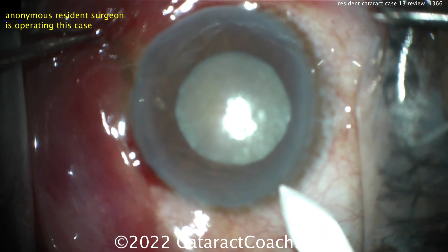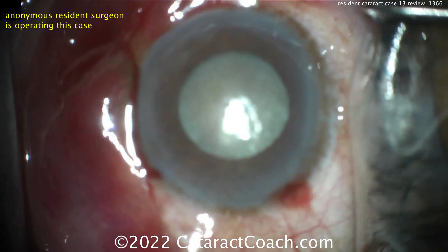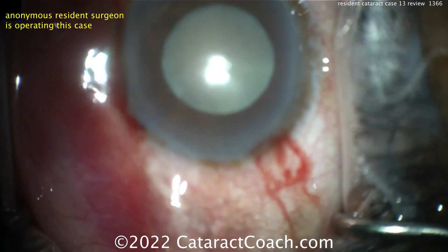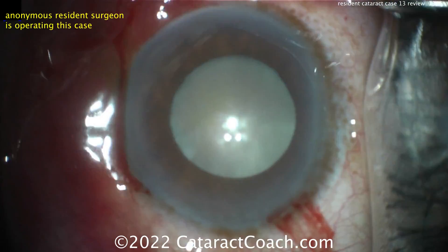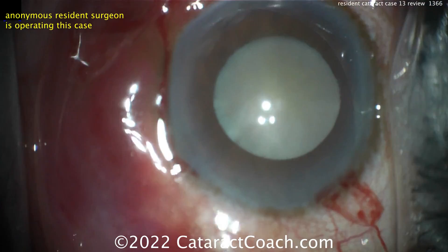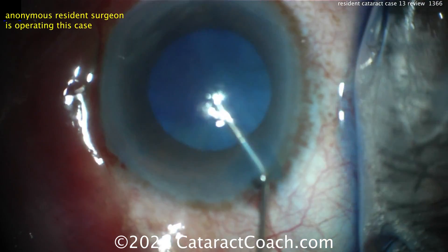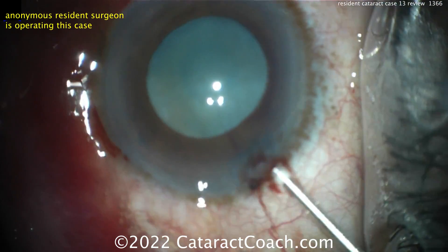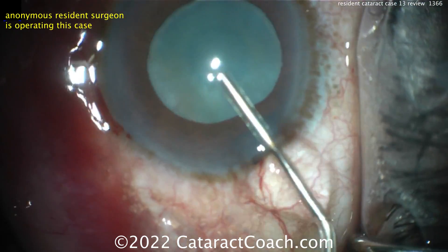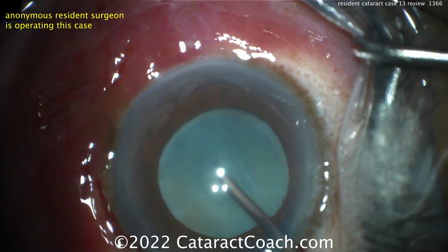Case number 13 — you can attempt this case, but you better have a really good attending helping you. The incision looks pretty good, hit the limbal vessels, maybe a little on the short side, but I'll take it. For case 13, it's pretty darn good. Here's the trypan blue dye — of course that's going to be needed. The key in this case is you need to get that pupil expanded; put some phenylephrine or epinephrine in the eye to get it bigger. Some more viscoelastic going in — you can get some viscomydriasis, that is helpful.